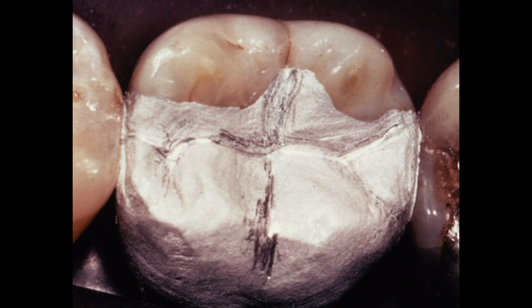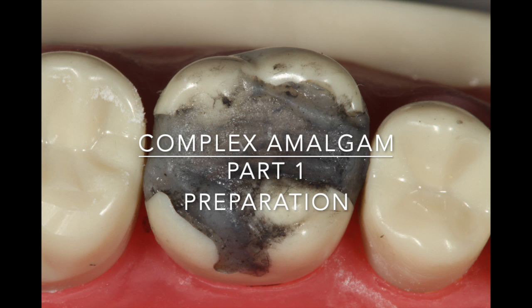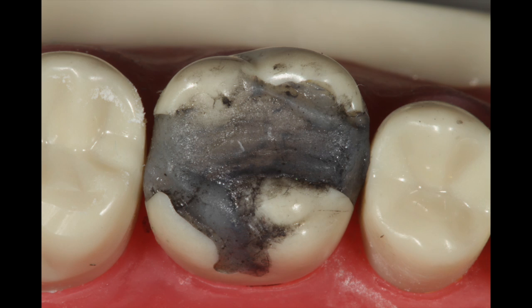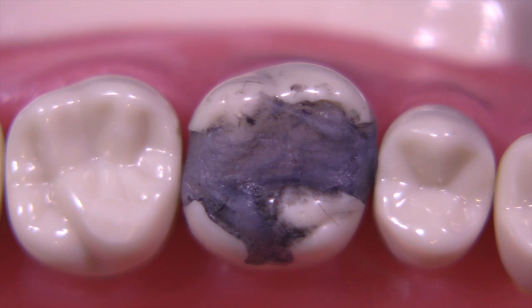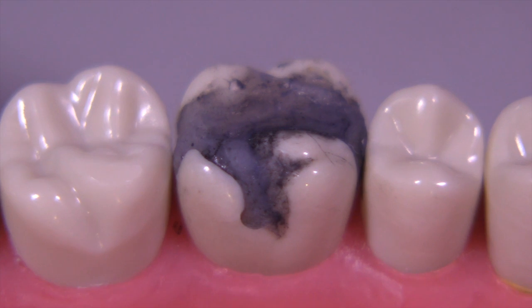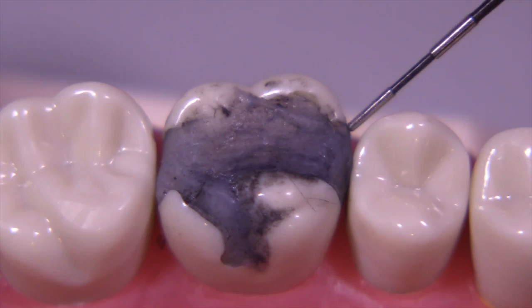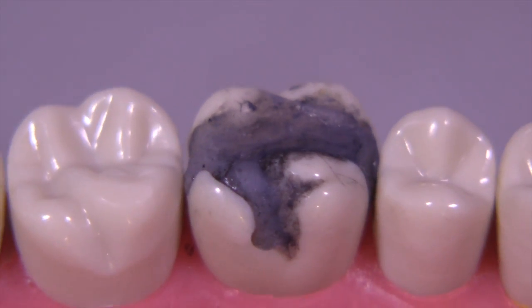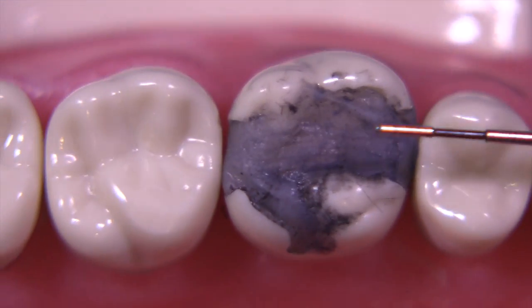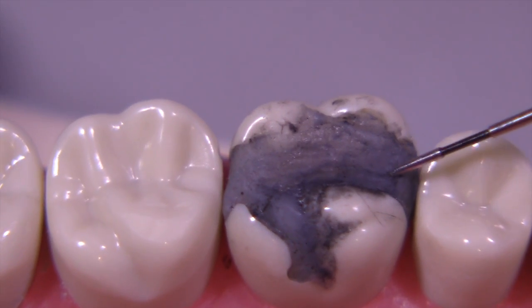Whatever the case may be, these preparations can be very tricky. Let's look at the complex amalgam in part one and do a little pre-prep planning. When we have a simulated defective restoration like this - which looks like horrible composite or maybe a buildup - and we're going to remove it, we need to know where we're going to end up, because we may end up removing some cusps, and in this case we definitely are.